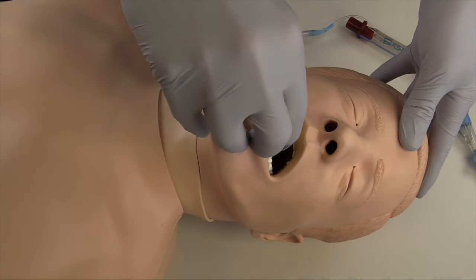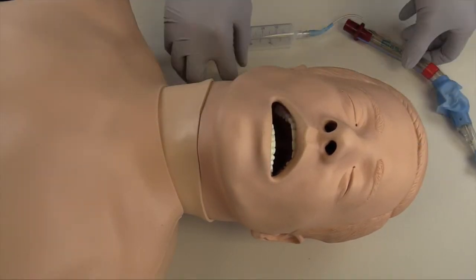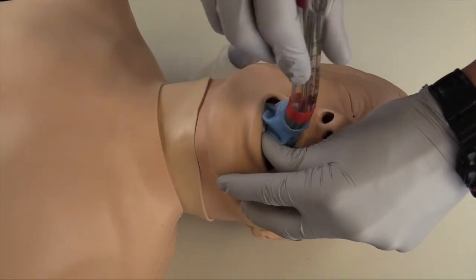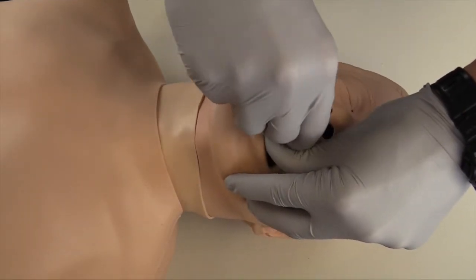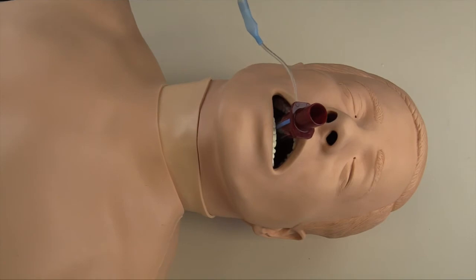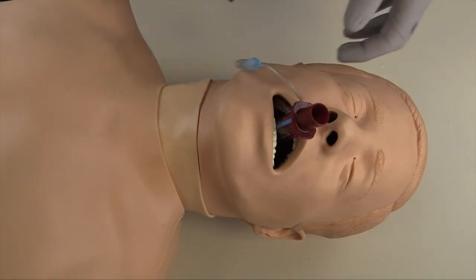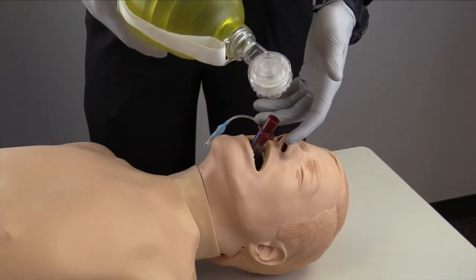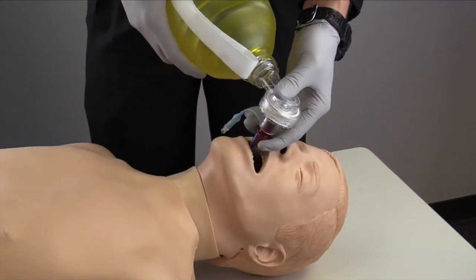I will then perform a tongue-jaw lift and advance the device into the airway to the back of the throat. I will then use the supplied syringe to inflate the cuffs with air and detach the syringe from the port. I will then attach the BVM to the airway device and deliver ventilations while watching for chest rise and fall.